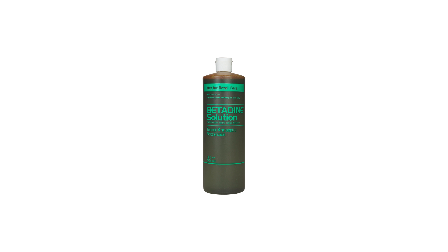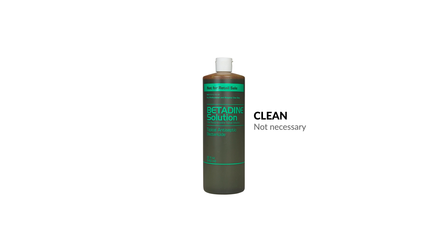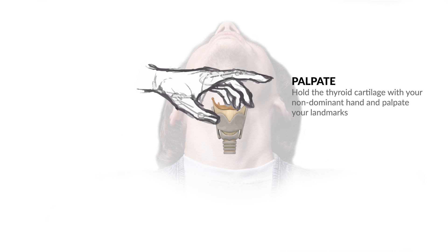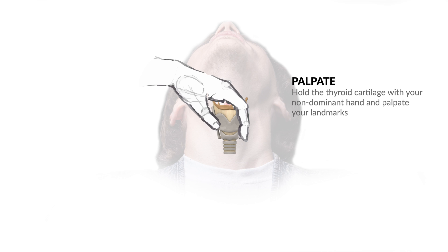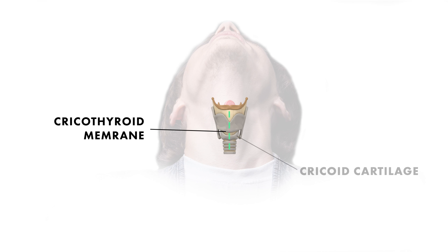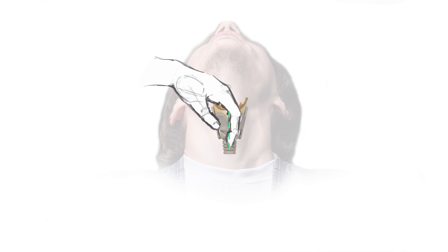If you have time, you can choose to clean, but remember — this is an emergent procedure, so cleaning is not really necessary. First, you want to palpate your landmarks. Use your non-dominant hand to palpate the thyroid cartilage. You could also feel for the laryngeal notch to orient yourself to midline. Next, palpate the cricoid cartilage to define the inferior edge of your target incision site, because the cricothyroid membrane lies between the cricoid and thyroid cartilage. Once oriented, feel midline for the cricothyroid membrane, which will be the target puncture site.